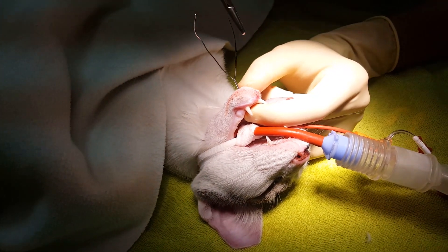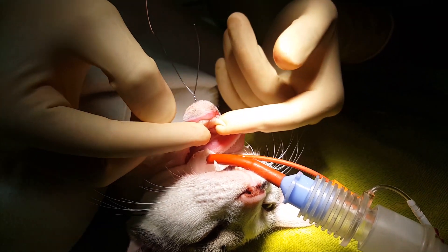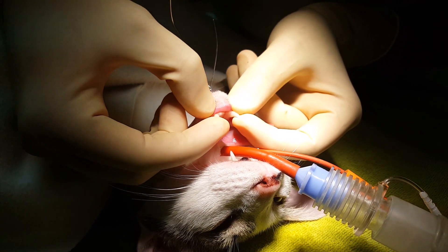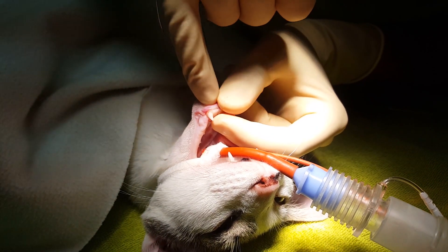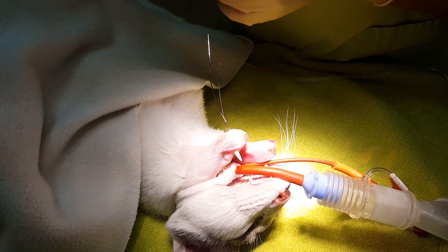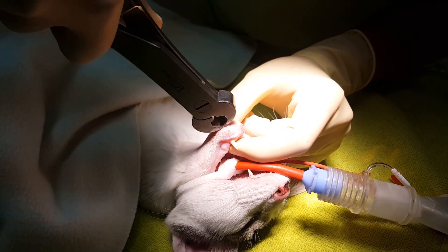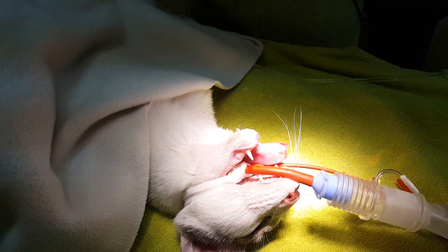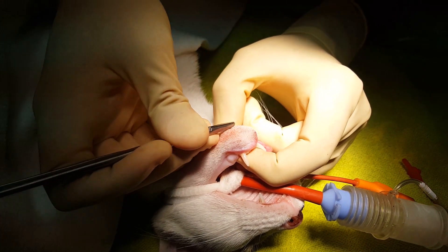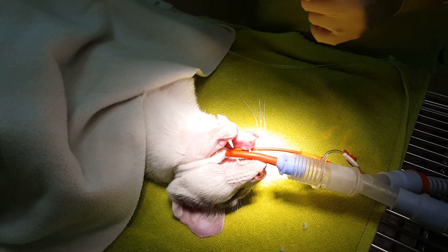Once the wire is in place, we need to tie the wire so that the two branches of the mandible don't move anymore. Now we have a nice solid jaw with no horizontal or vertical movement of the branches. The cartilage that connects the two branches is going to have time to heal without any more traumas. The last part of the procedure is removing the extra metal wire and gently bending this one so it doesn't traumatize the cat while eating — though again, for the next few days the cat is going to have a feeding tube and will be fed with a particular liquid food.